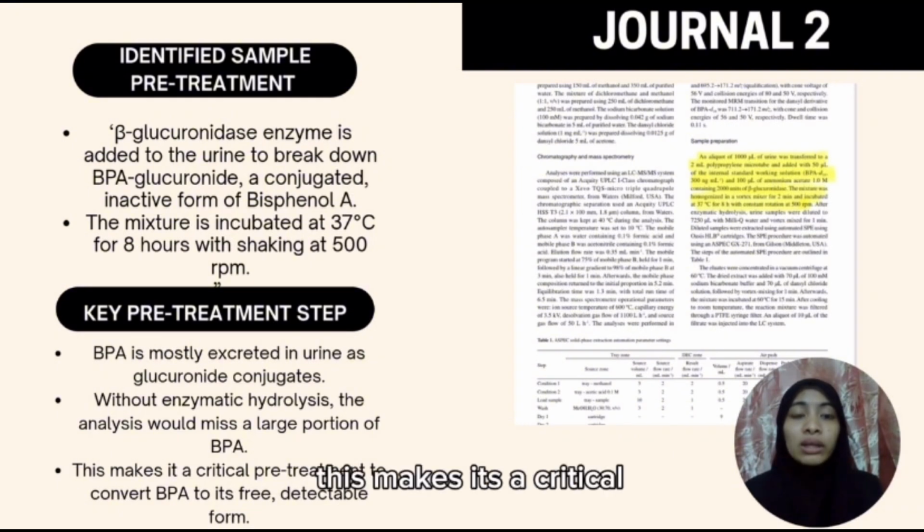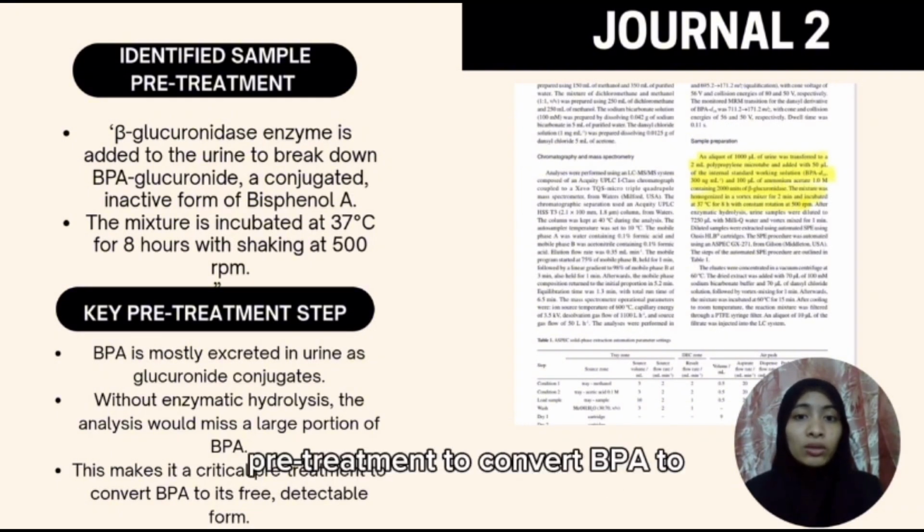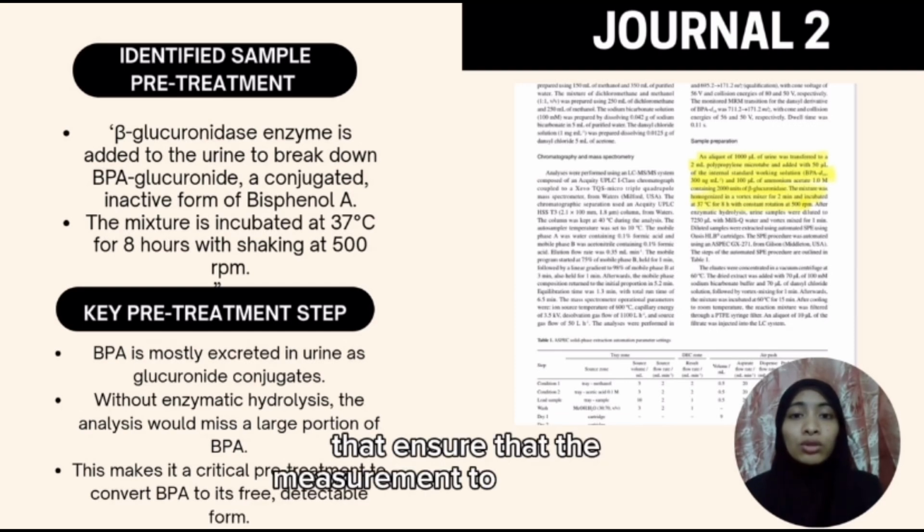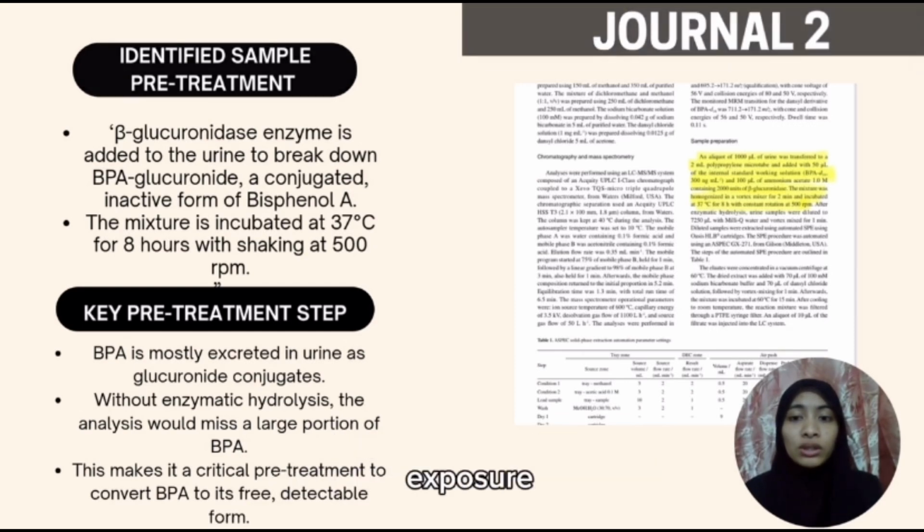This makes it a critical pretreatment to convert BPA to its free detectable form. This pretreatment step ensures that the measurement reflects total BPA exposure.